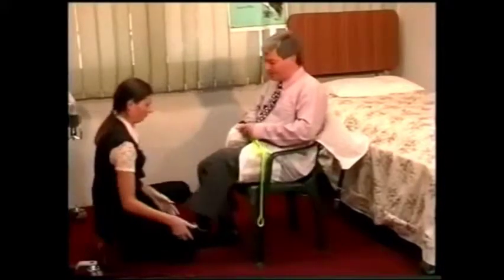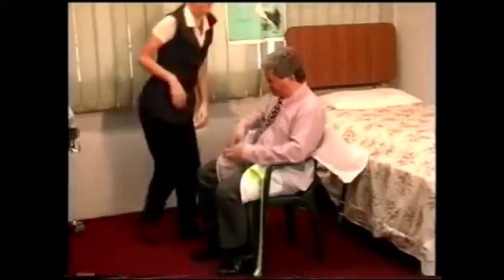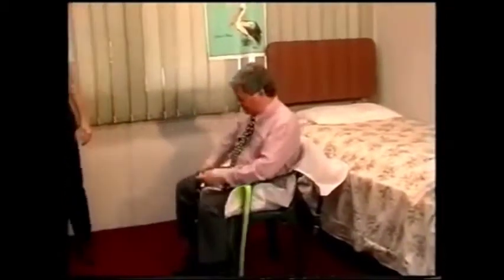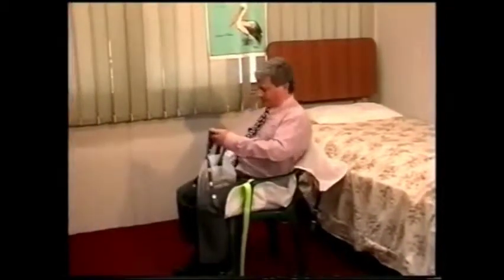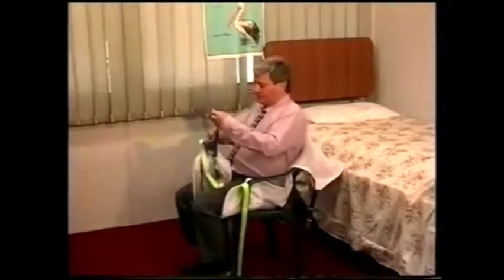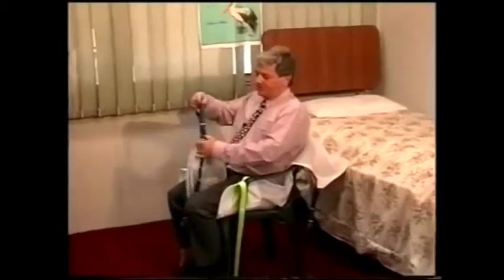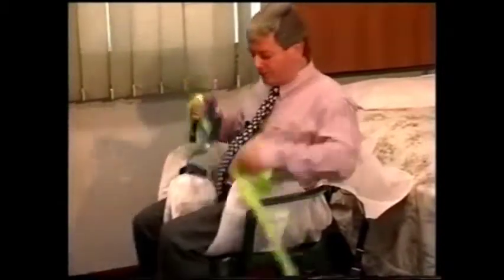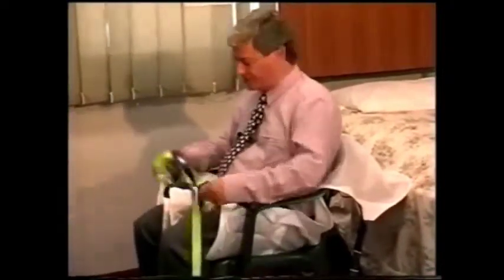Right here. Now, we just stop there for a moment, and I'll just show you a couple of things that you can do with this. At the sling level, you could put these two pieces of webbing through each other, and that will lock them together. So when you pick me up, and I hold on to the side pieces, you can open and close the legs without putting any pressure on the legs at all.